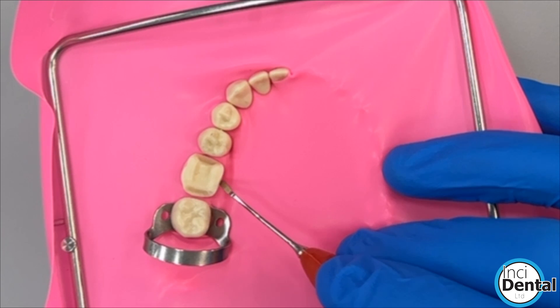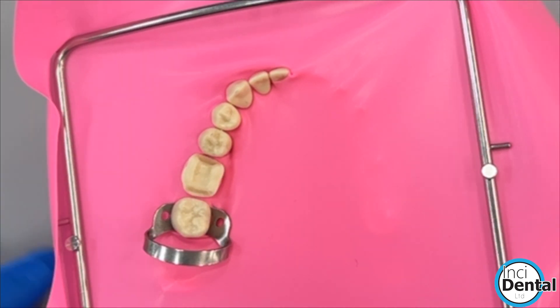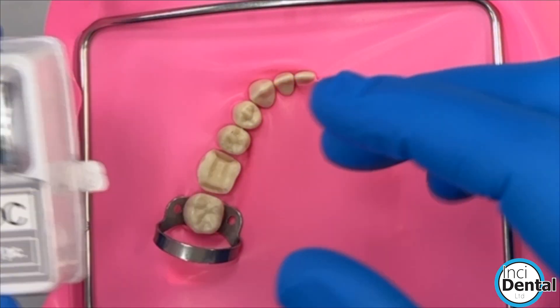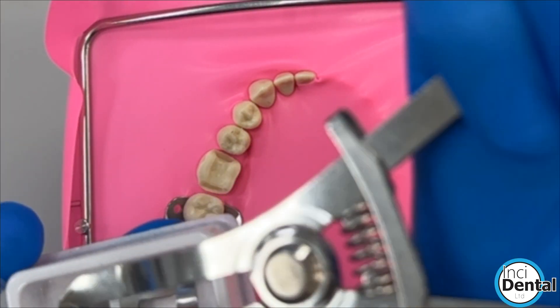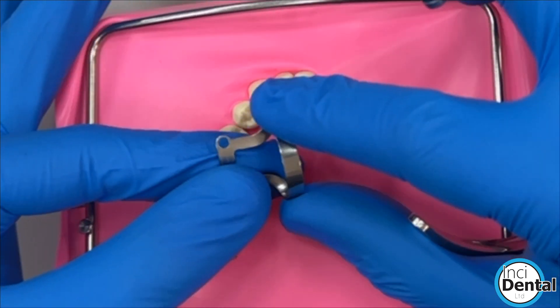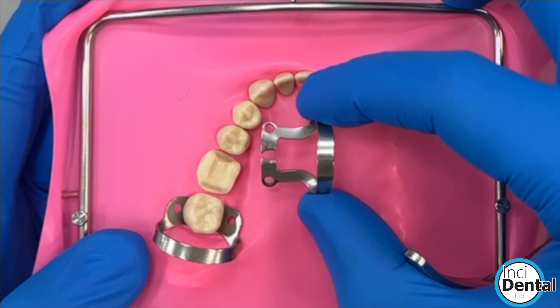Maybe you've lost a little bit of the bulbosity that makes it more difficult to invert, and so having an accessory clamp on the overlay can be really helpful. This is where the OC clamp can come in — the OC clamp is designed specifically for an overlay cementation, but it could also be used as a general accessory clamp as well.